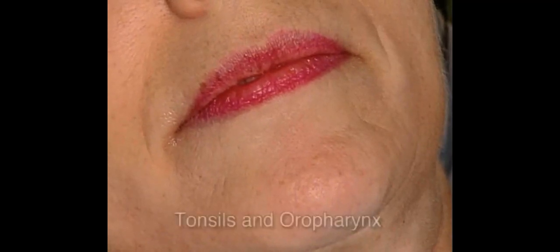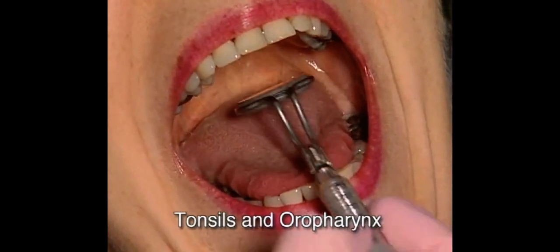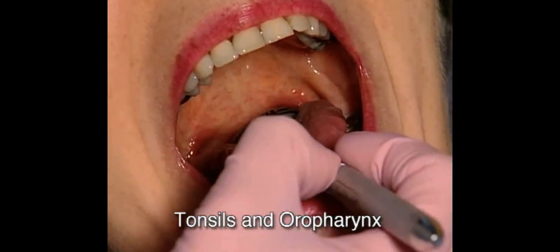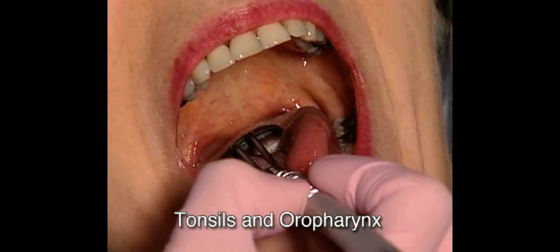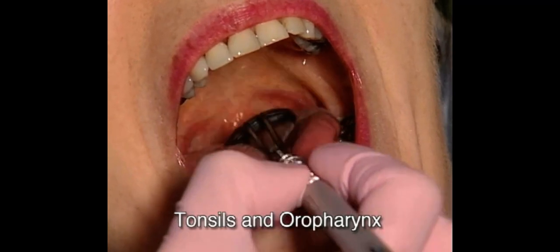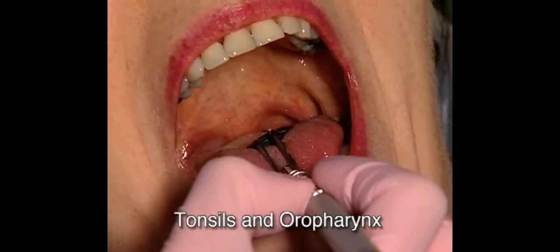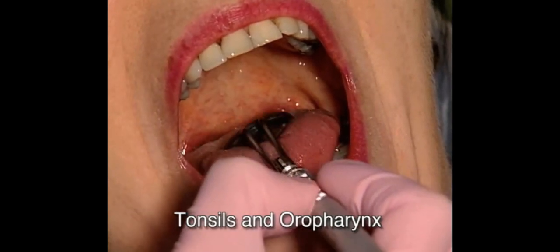Finally, inspect the tonsils and oropharynx. You will need a mouth mirror to move the tongue out of your line of vision. Position the mouth mirror with the reflecting surface down. Ask the patient to say "ah" as you depress the back of the tongue downward and forward. Moderate pressure is needed to keep the tongue out of your line of vision. Visually inspect the tonsils and oropharynx.